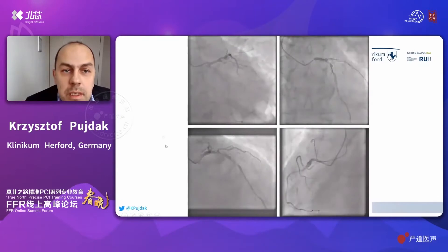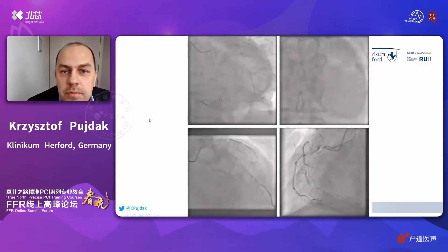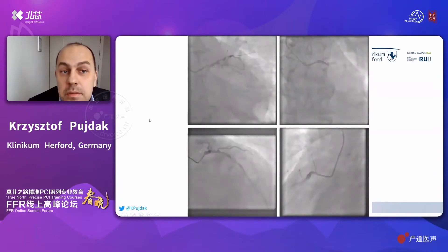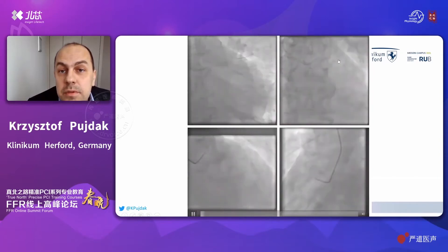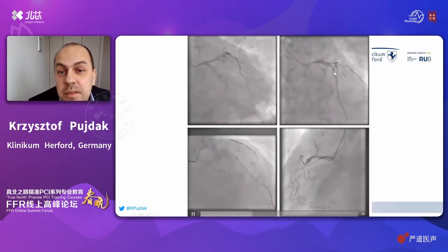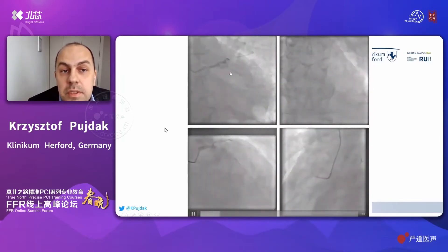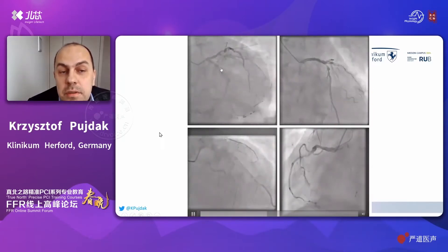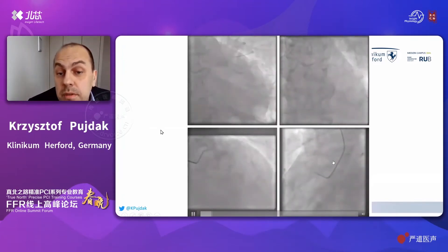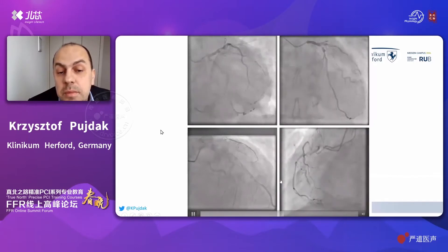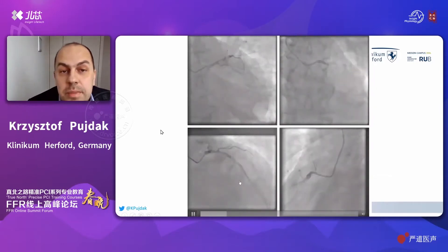Moving on to the coronary angiography: this showed severe three-vessel coronary artery disease with long and severe, quite calcified stenosis of the LAD. It also showed complex stenosis of the circumflex artery in the mid portion, and a chronic total occlusion of the right coronary artery with collateral filling from the LAD over the septal branches.